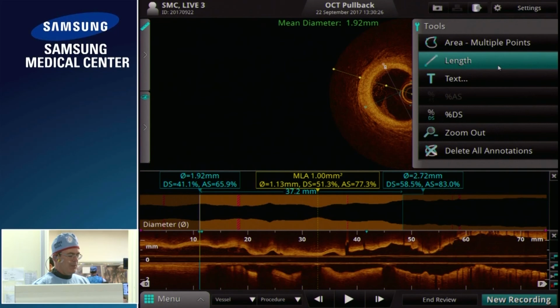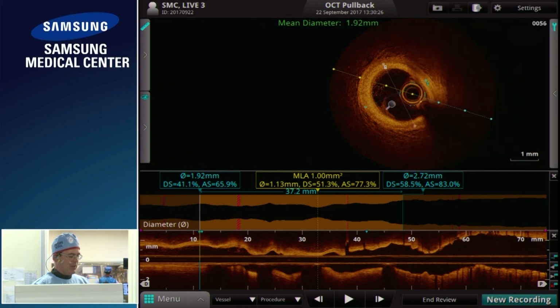Let me just show you how I would interpret this. In this distal vessel, there's a very slight bit of atheroma, but it's relatively undiseased. So 2.67 in one plane, the EEL measurement, 2.441. That would take a 2.5 stent, sized to the EEL.